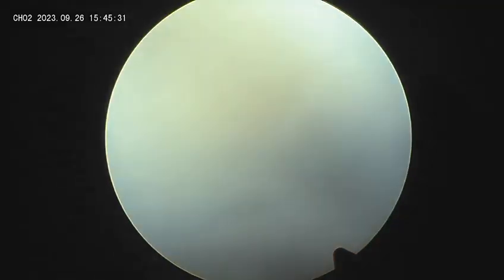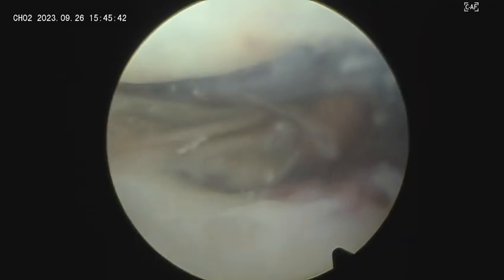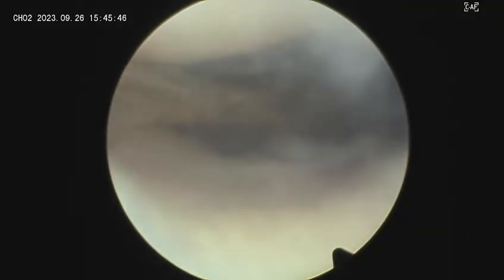So you can see here when we did a hysteroscopy that there is chocolate material draining from the cervical os. So this is the chocolate material that is collected at the isthmoscele. Now this is what was collecting during the monitoring of frozen embryo transfer cycles.